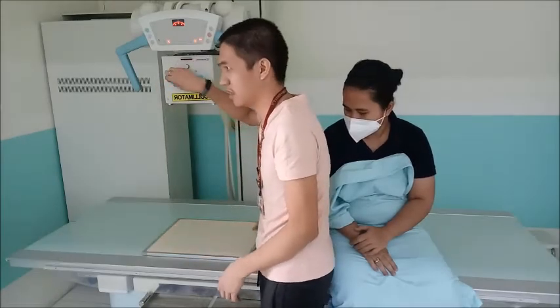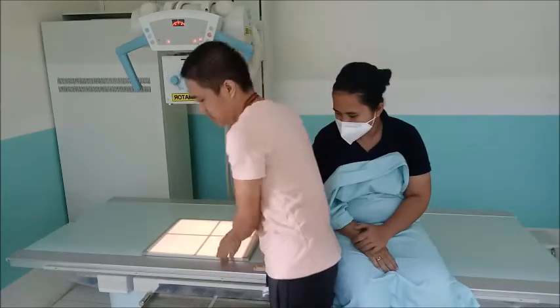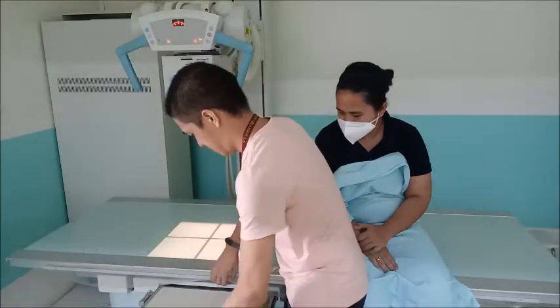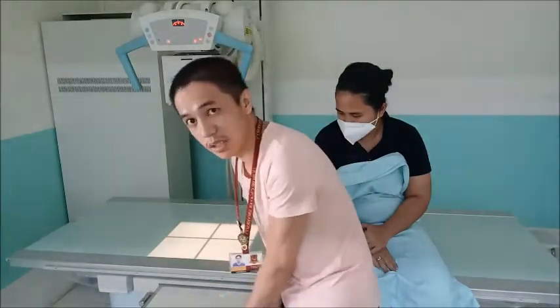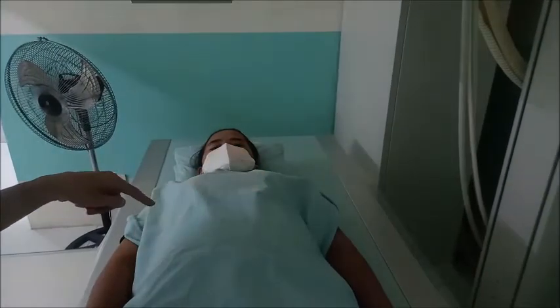Dili siya full blast. Yun, considered as full blast, kinalaman kasi mukhang full na opening of the shutter. Pero, that is required for the 40 SID, especially using 14 by 17. So, as you can observe, the centers atong central ray, wala sa center sa atong patient, no? Pero, kani siya, kaya nisiga naman to ganina. That means, kung insert nato siya, center niya, ang iyahang vertical niya ng center is already at the center sa ito ang tube.